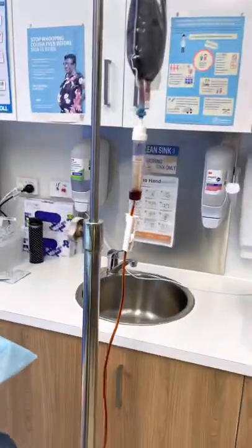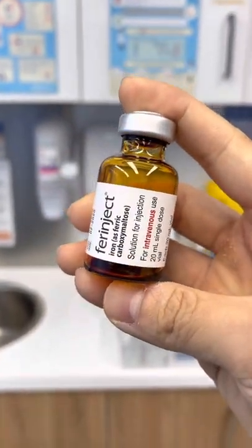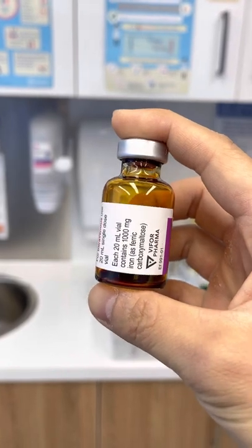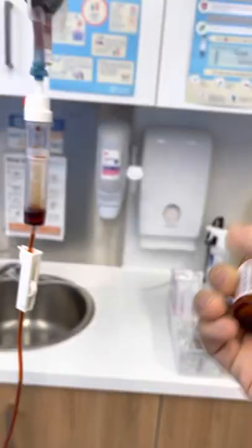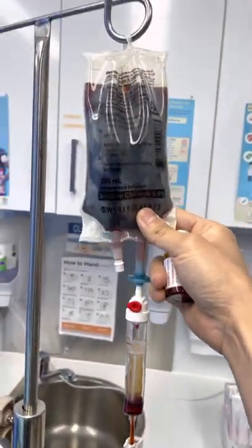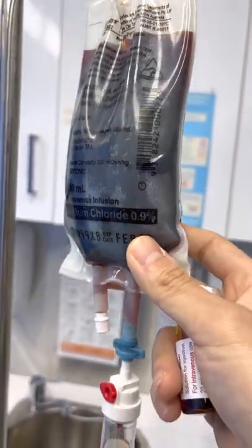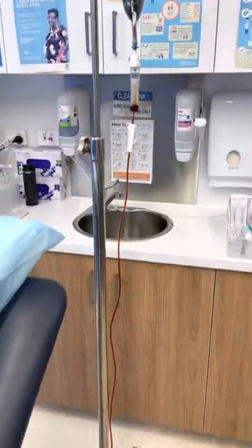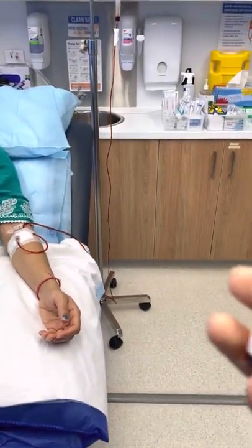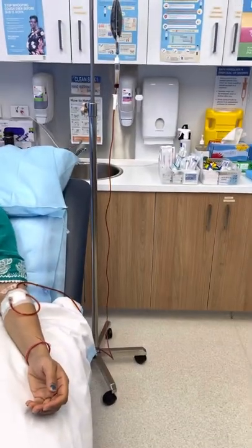We have put up this iron product called Ferinject, or iron carboxymaltose, which is 1000 milligrams in 20ml. We have put that into a bag of 250ml of normal saline. So this is one gram of iron carboxymaltose in 250ml of saline.